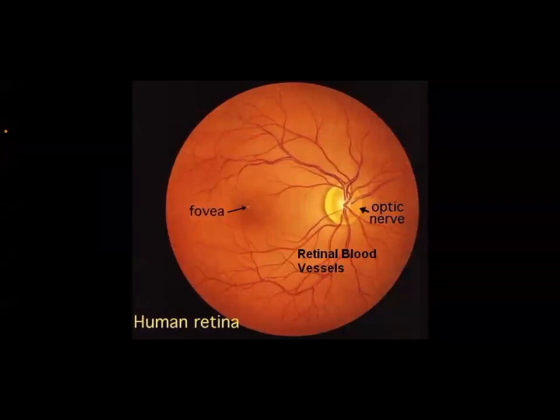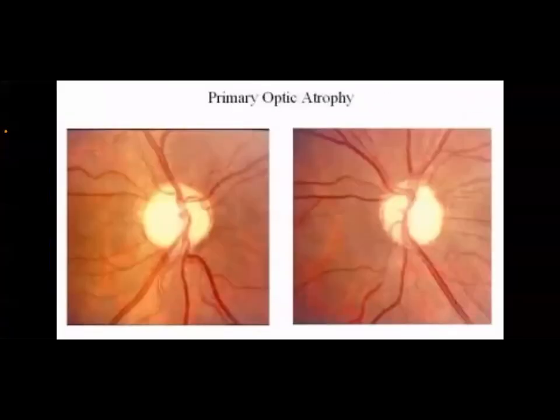Laterally to the optic disc, there is some area which is a little bit hyperpigmented, due to excess melanin deposition in the retinal epithelial cells. This area is called the macula, and the center of the macula is called the fovea centralis. This is very important, because if there is any maculopathy, findings will be in this hyperpigmented area. We will come to this later on. For now, what I want you to know is the normal shape of the optic disc and the optic atrophy.